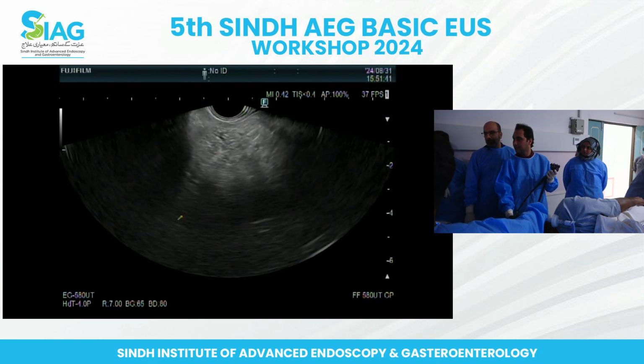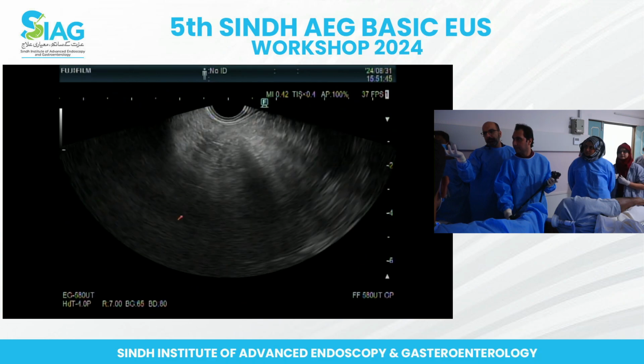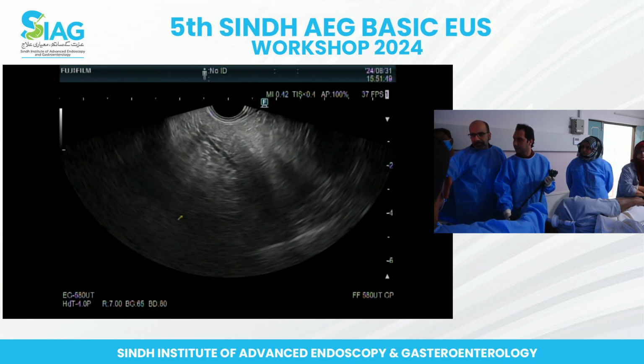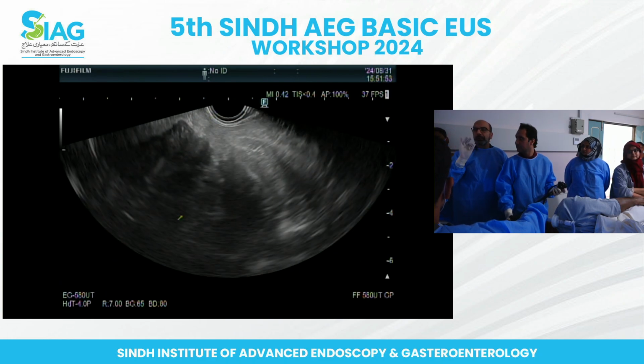You follow the pancreatic duct, right? Because that's what our organ of interest is primarily here. But if you have pancreatic lymph nodes, that's what you're looking for, yeah, there you go. It's nicely dipping down towards the tail. Okay, good. Let's go to the bulb because we have a timer.